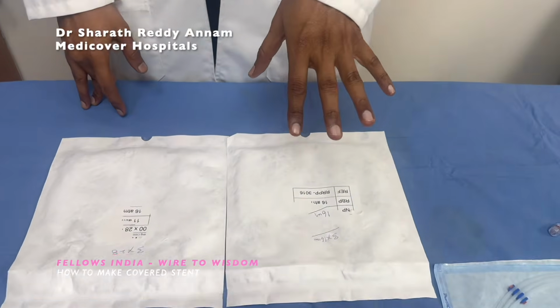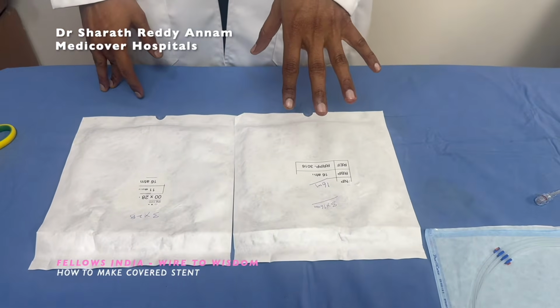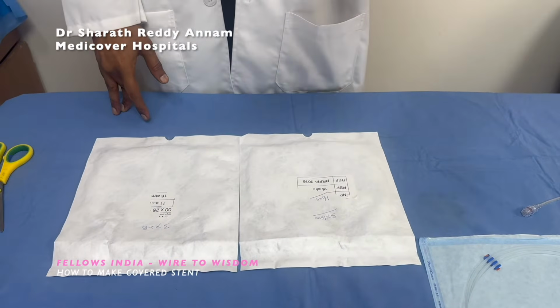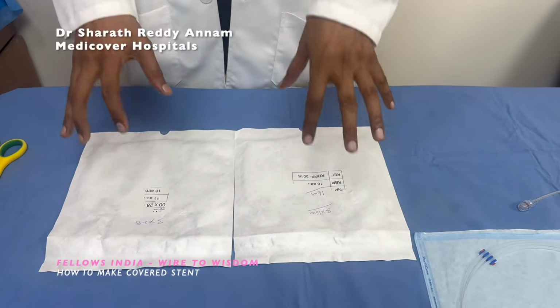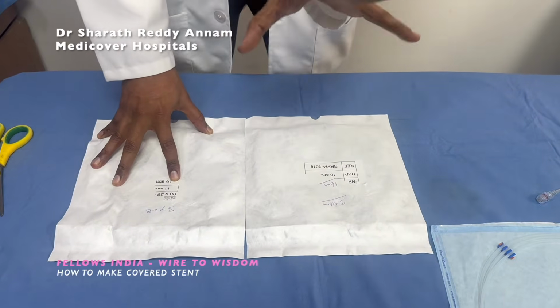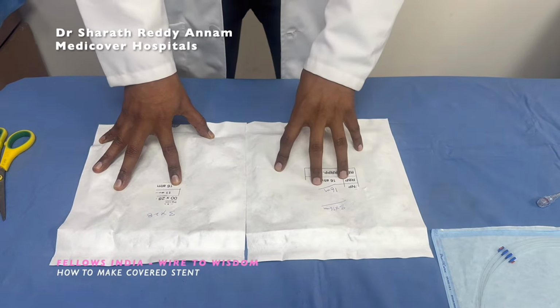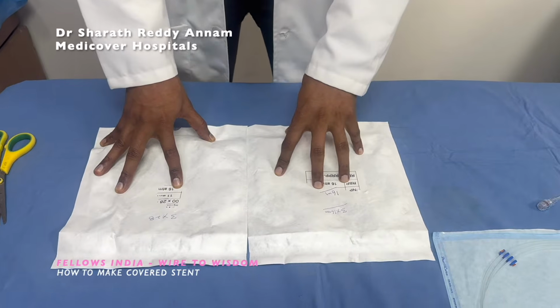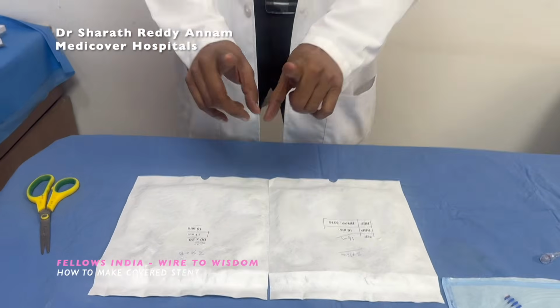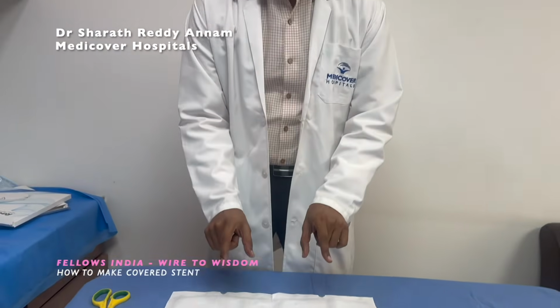So you need basically stents which fit into the artery size. In this I'm using a 3mm stent, which is the most common stent we use in epicardial coronaries. You need two stents with different lengths.